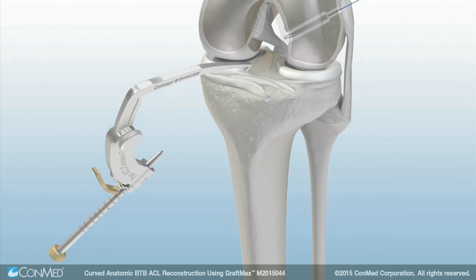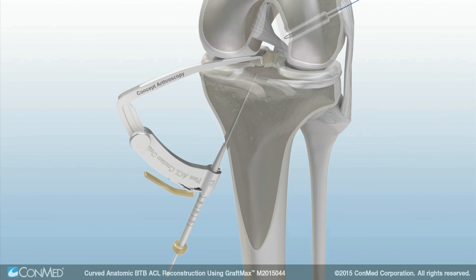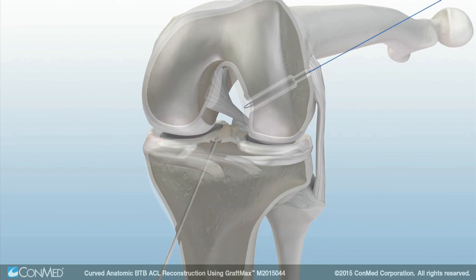Next, position the tip of the bullseye tibial footprint guide in the center of the tibial ACL footprint. Advance the tibial guide pin until it meets the point of the guide arm. Then remove the guide from the joint.